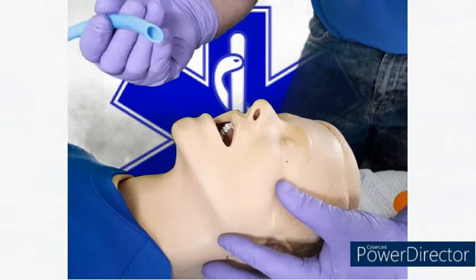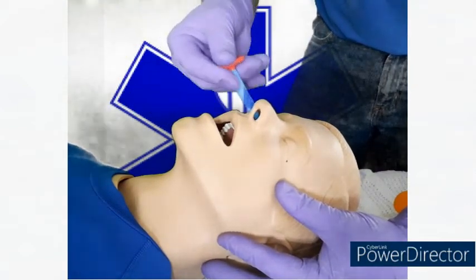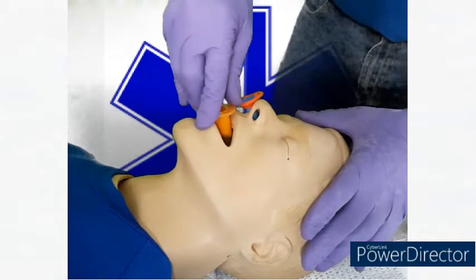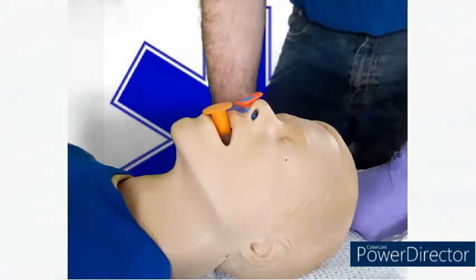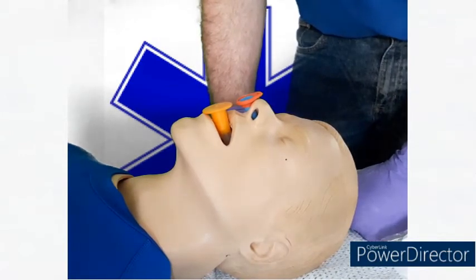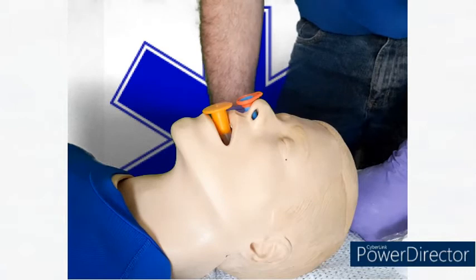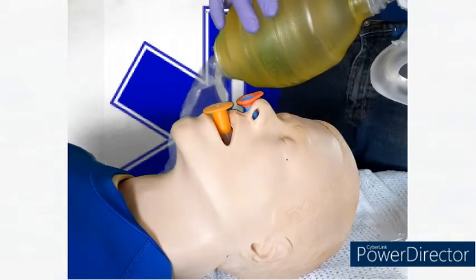We could use a nasopharyngeal airway with the right nostril first, and that comes in and slides down with some lubrication on. We could then measure and insert our OPA, and now the patient can breathe. If their oxygen saturations were below 94, we might put oxygen onto them. And if their respiratory rate was below 10 or above 30, we may need to ventilate the patient, and that's where we can use our bag valve and mask.